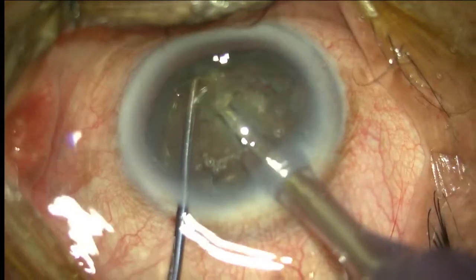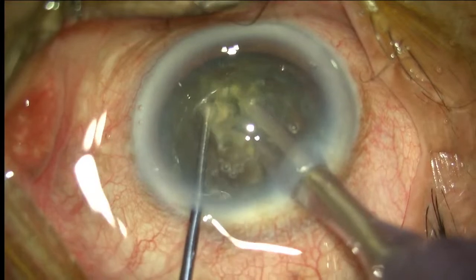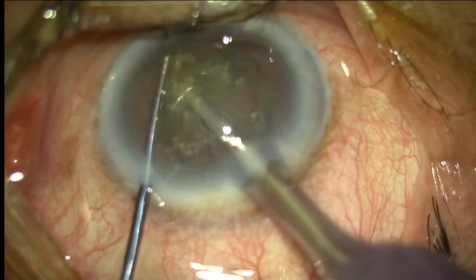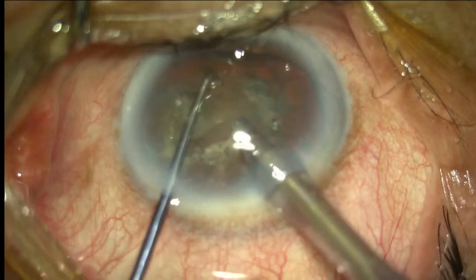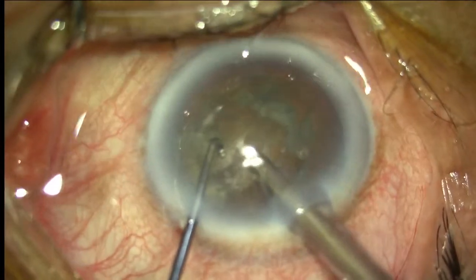So this is how I hook it, and you crack the nucleus here. So a small crack has happened, not the full crack. I'll just go from the saline.